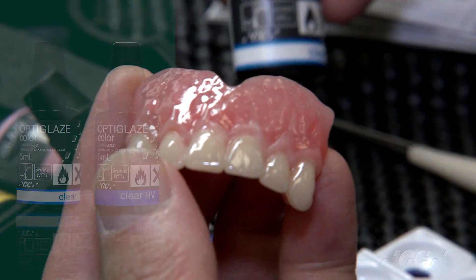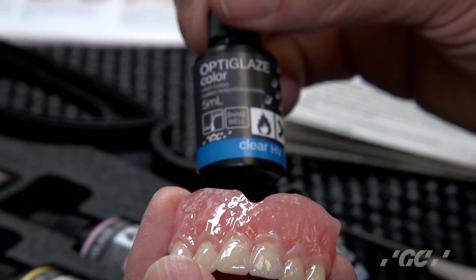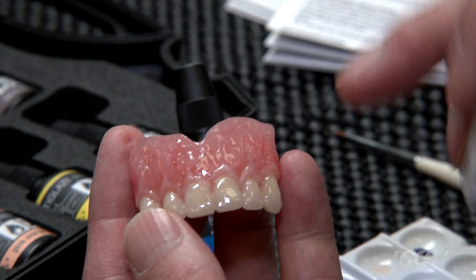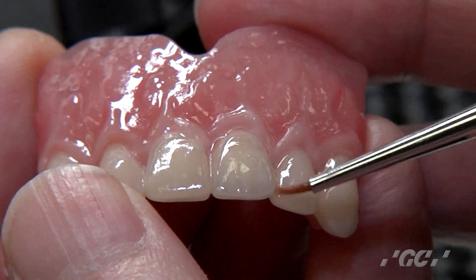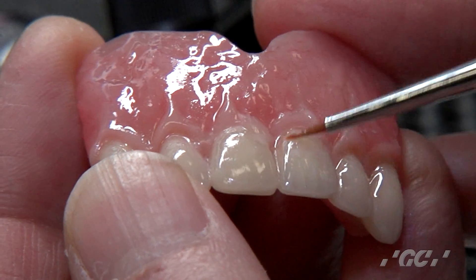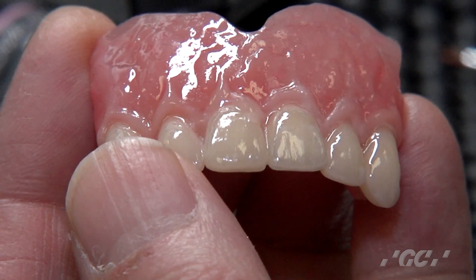Apply one more coat of clear or clear HV before the final cure. The thin clear is about 5 to 15 microns, while the HV clear is about 10 to 20 microns — a little bit thicker. Since I've already applied a lot of material, I'll use the thin clear as a final layer on top of the denture tooth or temporary crown to completely seal it.